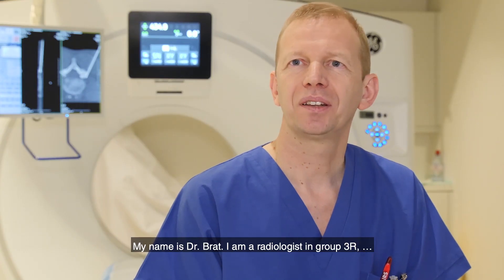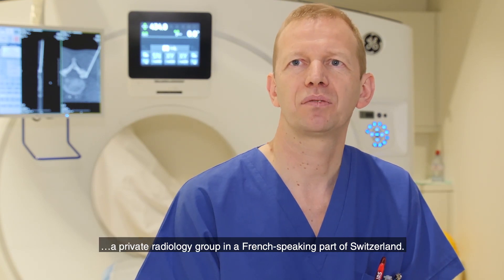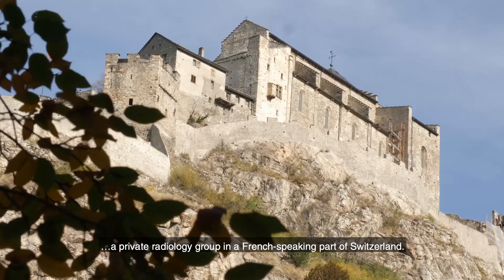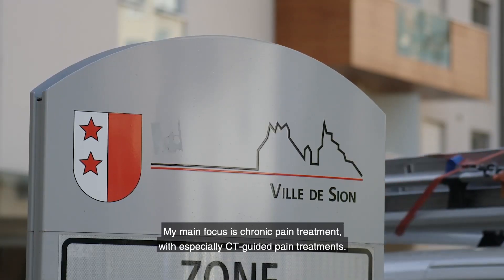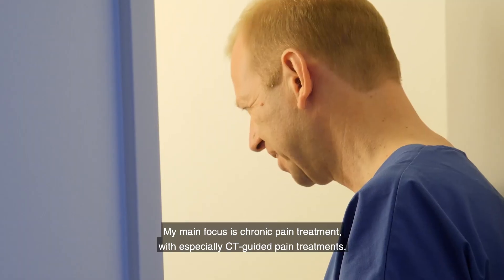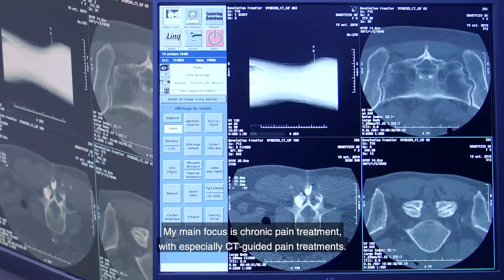My name is Dr. Brat. I'm a radiologist in Group 3R, a private radiology group in the French-speaking part of Switzerland. My main focus is chronic pain treatment, especially CT-guided pain treatments.